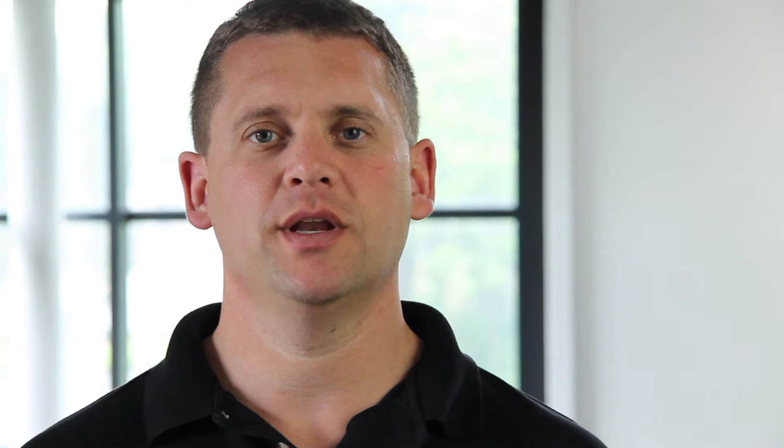They are also commonly used for securing dressings or when protecting the ears in rugby. Examples include Vivo Sportswrap, Vivo Plast, Tenso Plast and Leukoband.